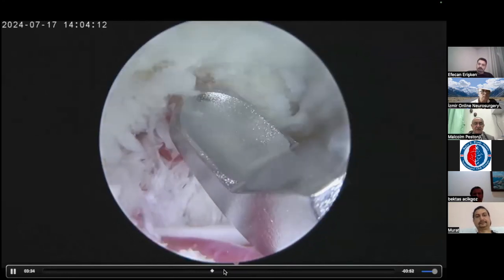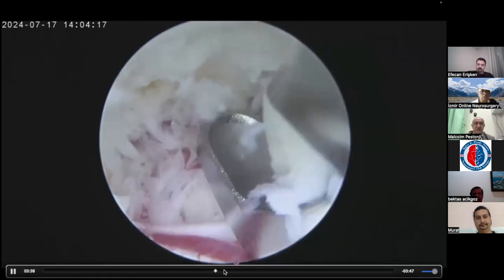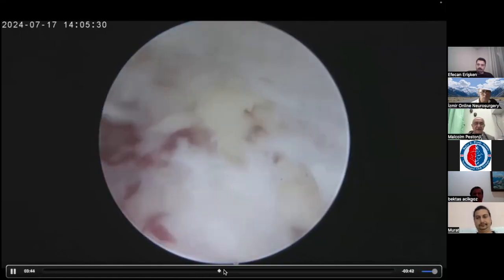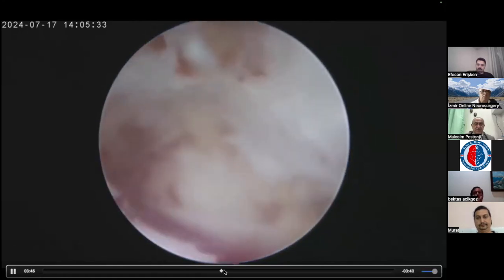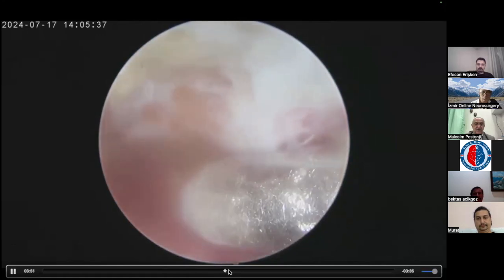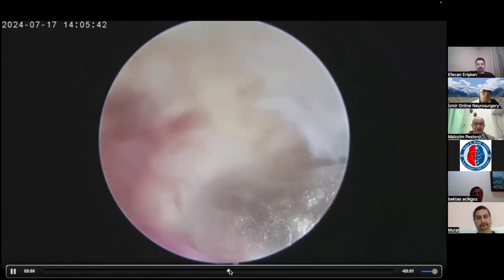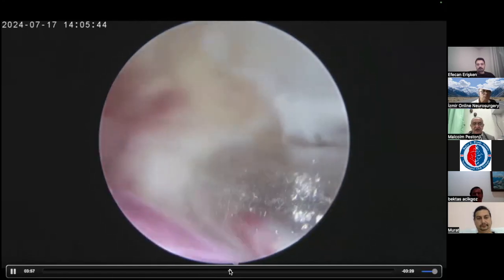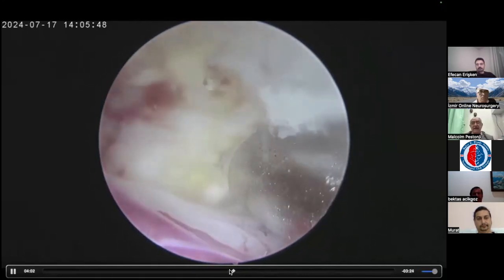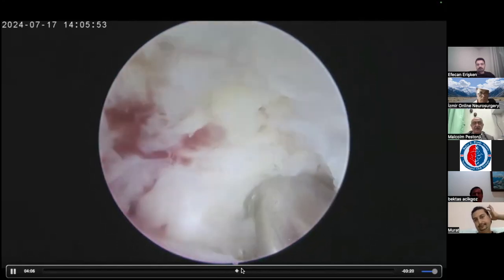So slowly cutting into the foramen and opening up the whole foramen, making sure first that the dorsal roof is opened up. You can see the discal surface below. You can see the disc over there below. Field gets a little bloody, you need to control the bleeding. Now that is a disc which I'm burning. That is the herniated disc, which I'm using plasma to ablate away. See the fragment over there.